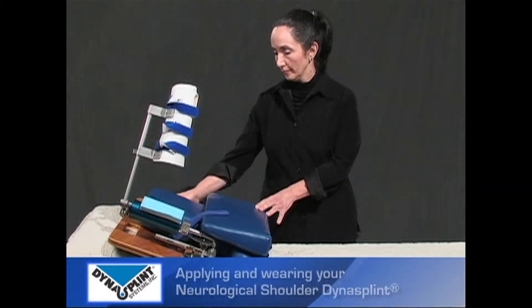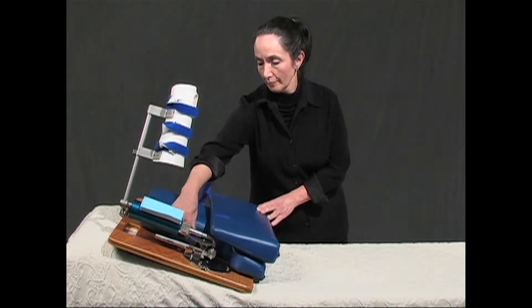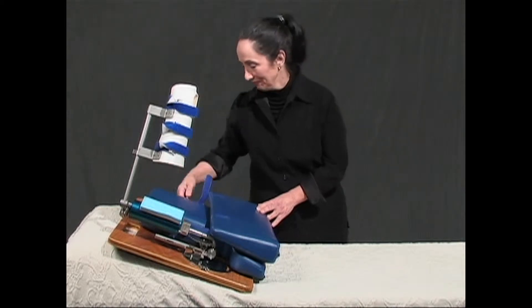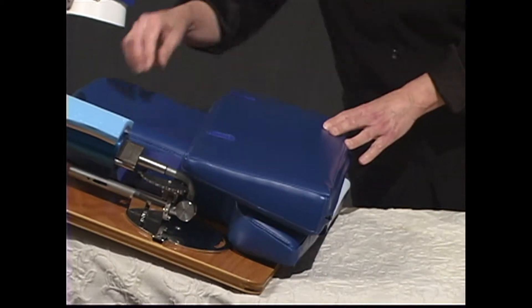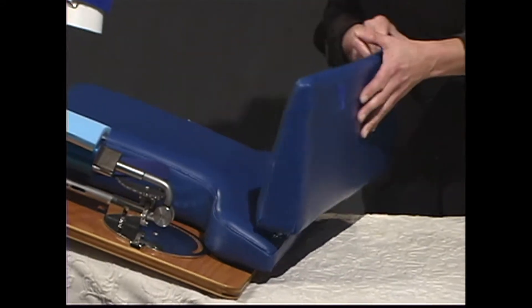When getting your patient into their shoulder DynaSplint, first prepare the system by placing the unit at the head of the bed or couch. Remove the straps from the pillow and lay out the pad, reattaching straps to the pillow.